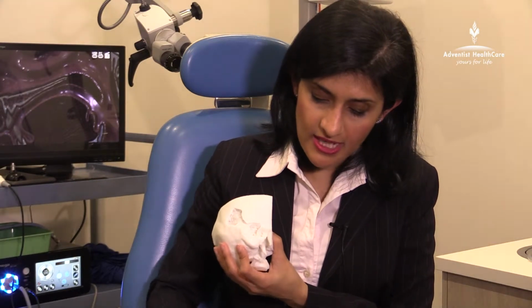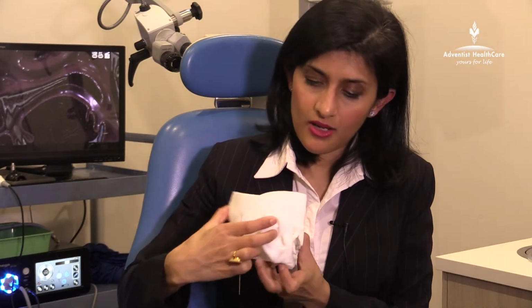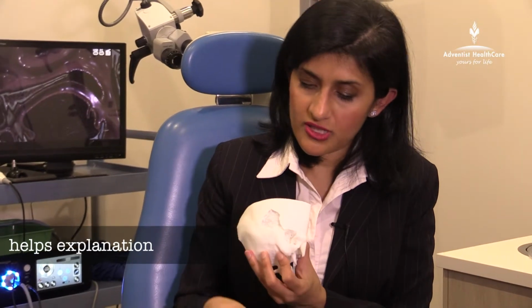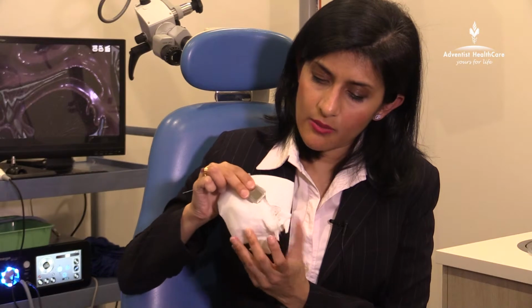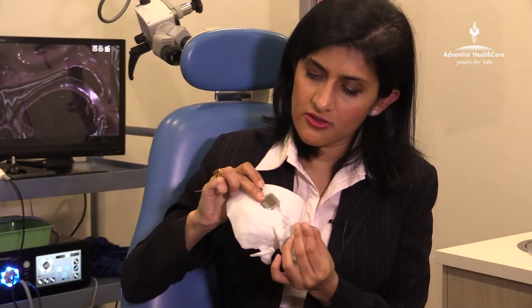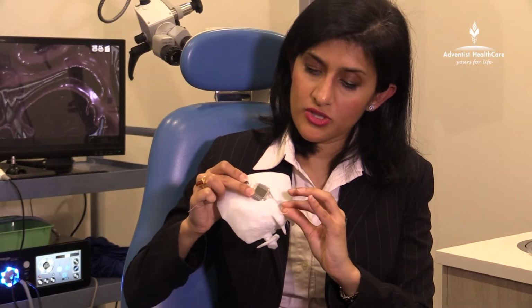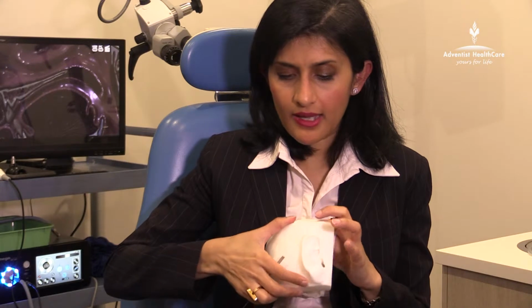So what I can say to the patient is, look, when we start off, we make a cut in the ear, we push the skin apart, we then expose your bone. This is the surgery that we do, these are our boundaries, and then what we do is we pop the implant in. The device looks like that. That's the electrode that sits within the cochlea, which goes in through there, and then when we put the skin back, we put the external device.